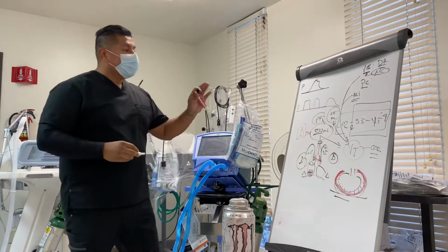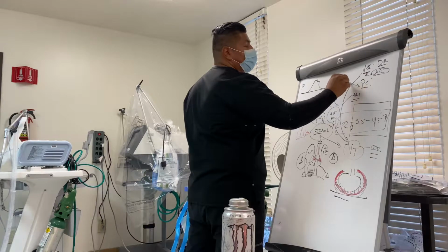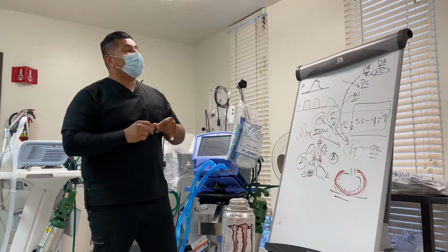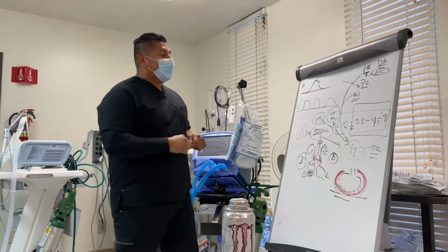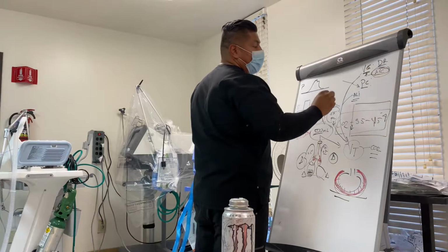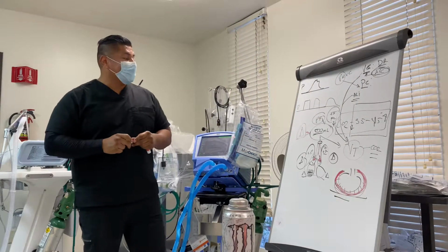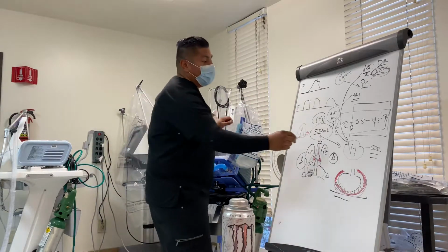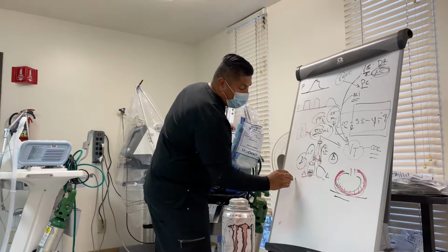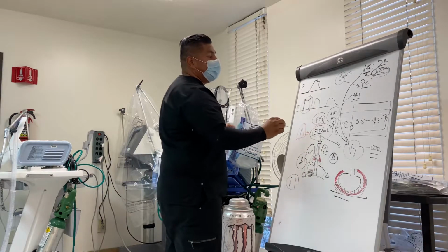Well, with pressure regulated volume control, it takes these two worlds and combines them into one. Now, what does pressure regulated volume control do? What's the difference between standard AC and PRVC? Well, the first two letters are pressure regulated, which means that whenever I change my ventilator from delivering tidal volume and direct flow control, this flow control will shear the lungs. You want me to hold it? I'm going to just deflate it again.